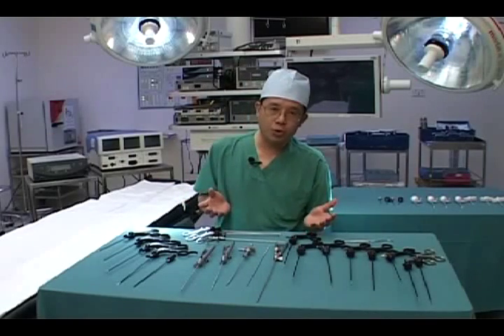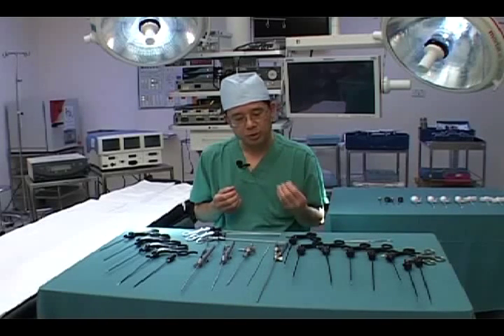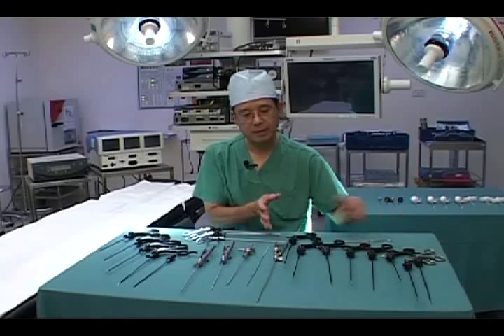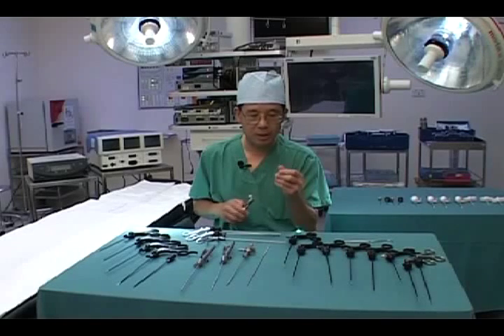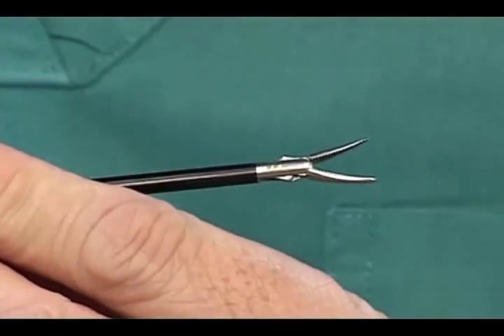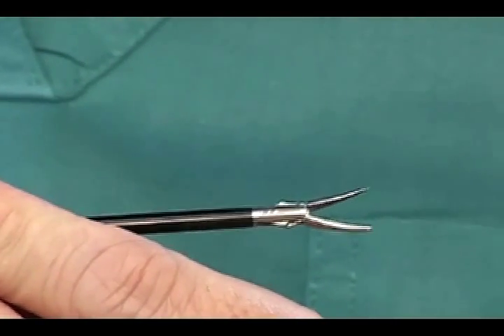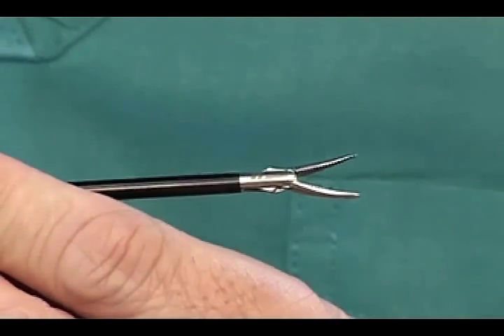For older children, or cases that may need stronger retraction or stronger tissue handling, I oftentimes use a 3.5mm instrument, which is on my left-hand side. For older children requiring reconstruction, I will need a longer 30cm needle holder. This is a 3.5mm Maryland dissecting and grasping forceps with a nice fine tip, good for fine dissection in an older child or if you require a stronger grip or more forceful tissue handling.